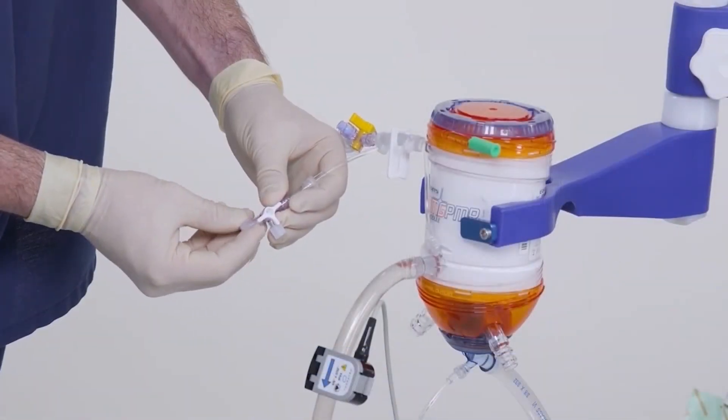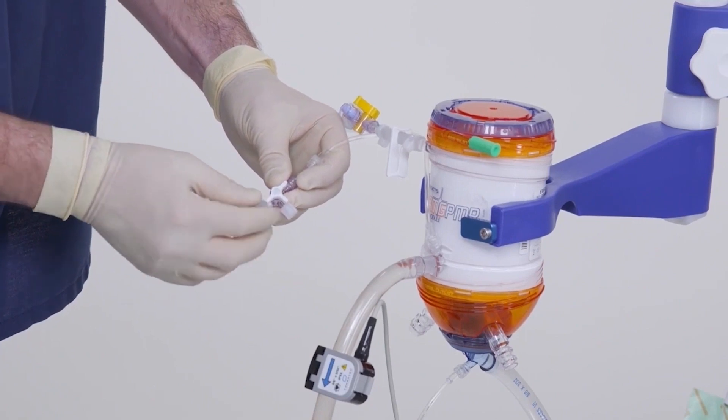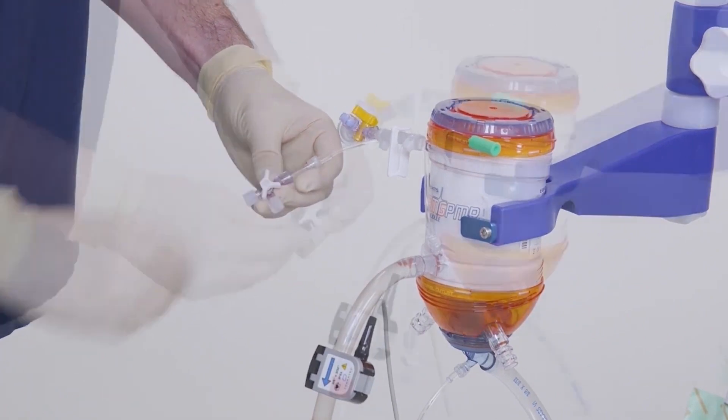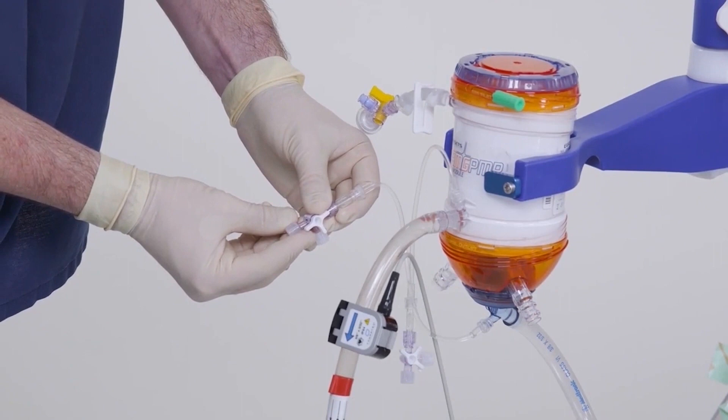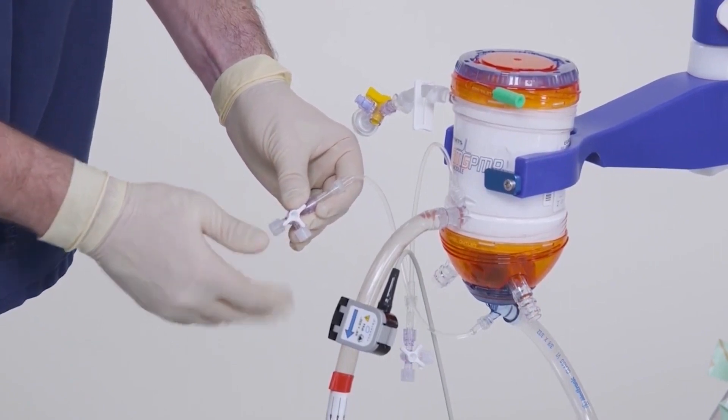If the pigtails were used, de-air the lines by opening the stopcock and slowly removing the cap. Once the lines are purged, re-close the stopcocks.